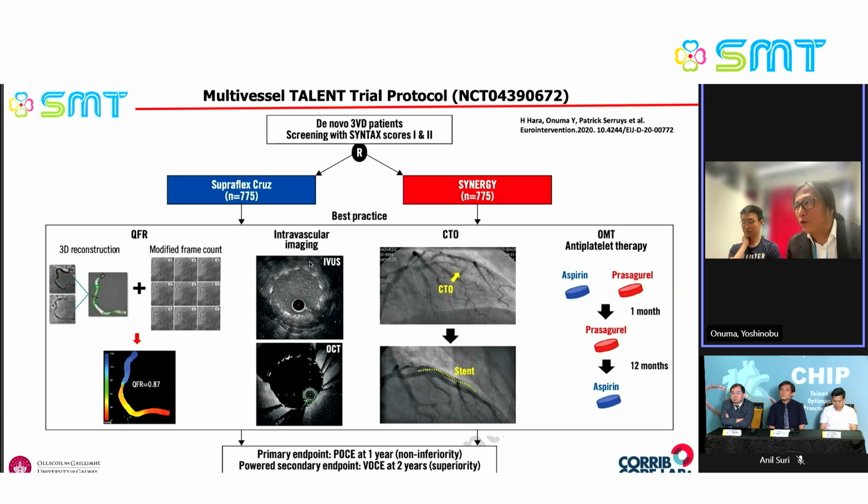Intravascular imaging post-procedure is mandatory, and we use contemporary CTO techniques to treat total occlusions. And we have a cutting-edge optimal medical therapy, including short DAPT, aspirin plus prasugrel for 1 month, and after that prasugrel monotherapy for 11 months.